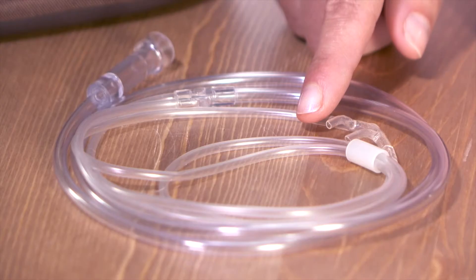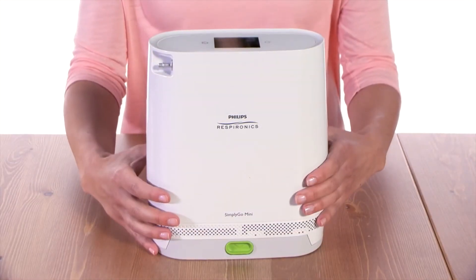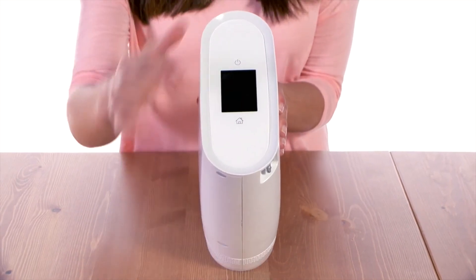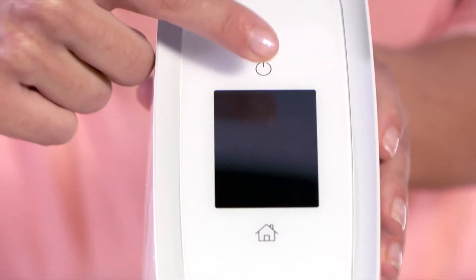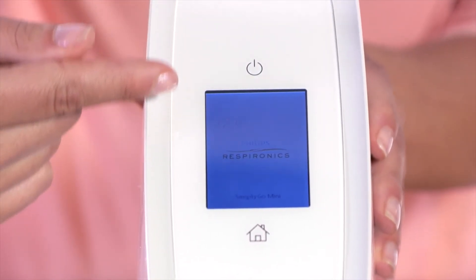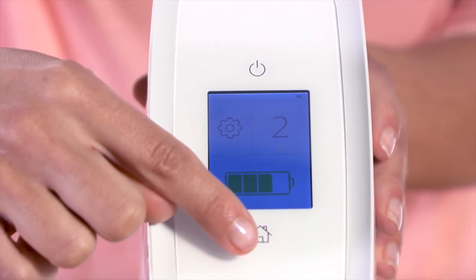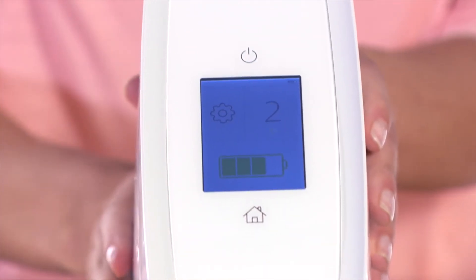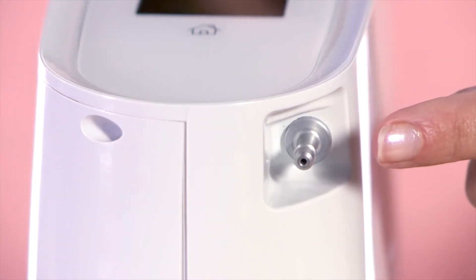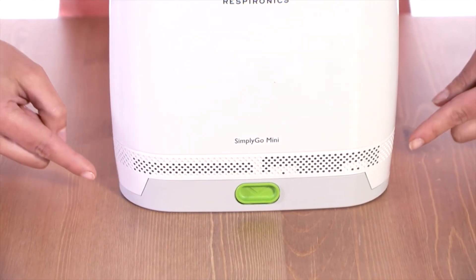You will also need a cannula and tubing. If you take a look at the Simply Go Mini device itself, you can see a control panel at the top. The power button is used to turn the device on and off. The display screen shows information about its operating status and settings. The home button accesses the home screen, which is currently displayed. A patient cannula connector is set into the side and a rechargeable battery is attached to the bottom.